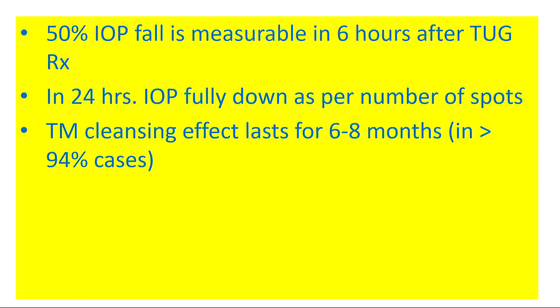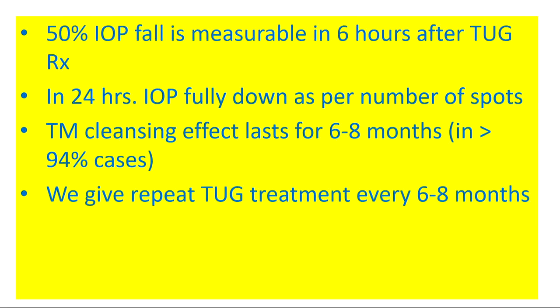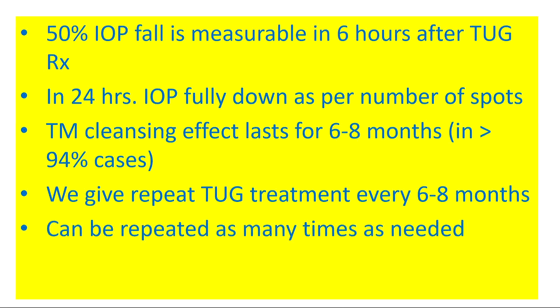Trabecular meshwork cleansing effect lasts for 6 to 8 months in more than 94% of cases. We give repeat TUG treatment every 6 to 8 months, and it can be repeated as many times as needed for the lifetime of the patient.